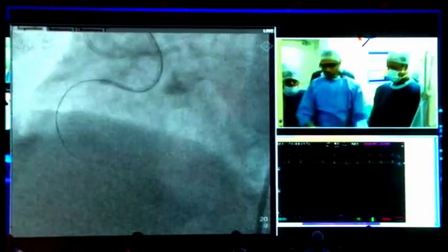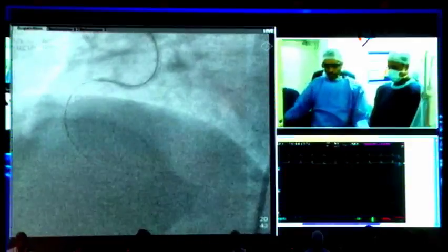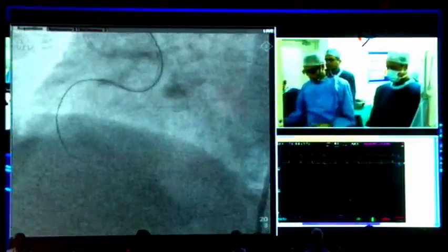You guys just got us live right at this point. So I'm actually going to take a simultaneous picture right now to see what we're dealing with at the present time.